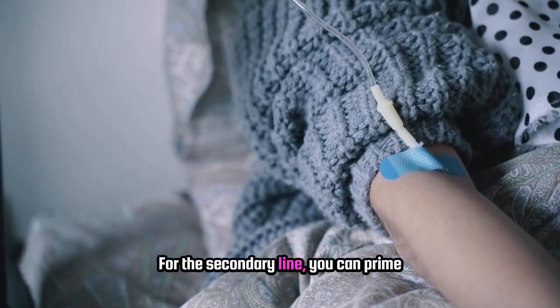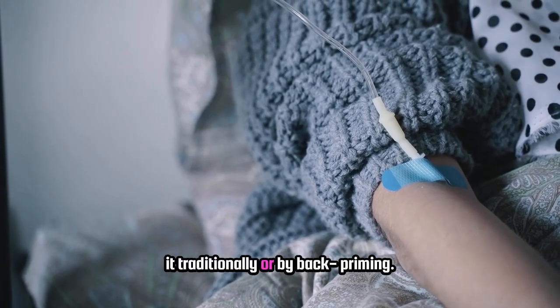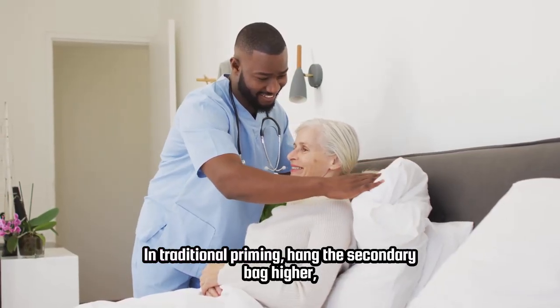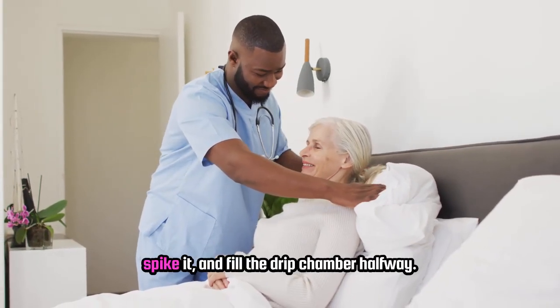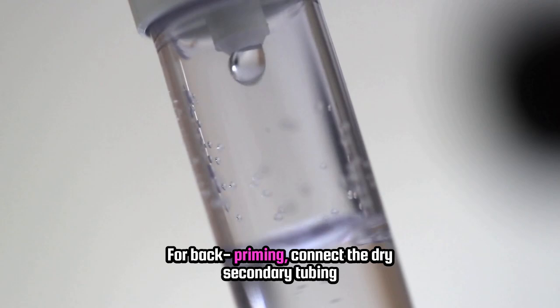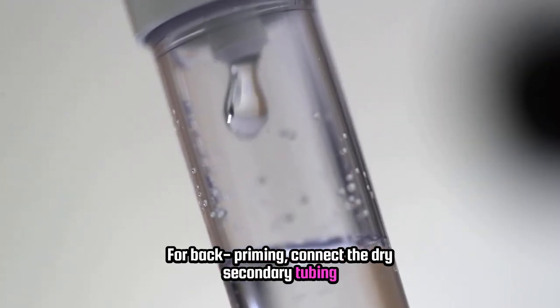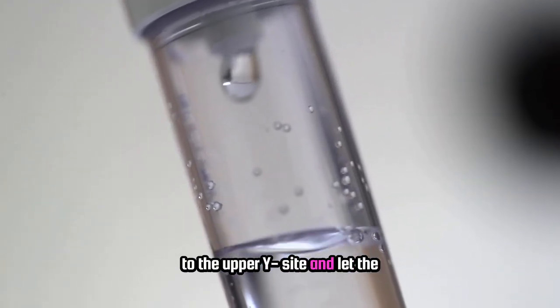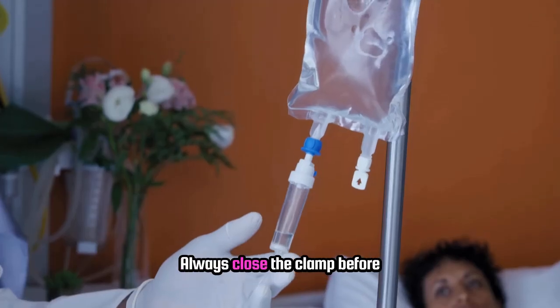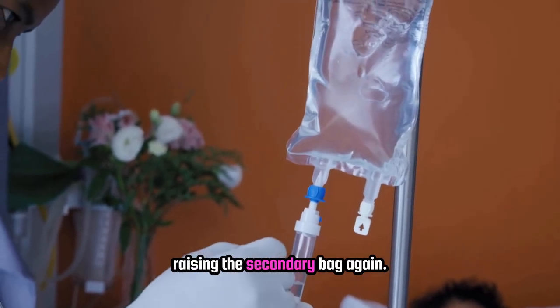For the secondary line, you can prime it traditionally or by back-priming. In traditional priming, hang the secondary bag higher, spike it, and fill the drip chamber halfway. For back-priming, connect the dry secondary tubing to the upper Y-site and let the primary solution back-fill the secondary tubing. Always close the clamp before raising the secondary bag again.